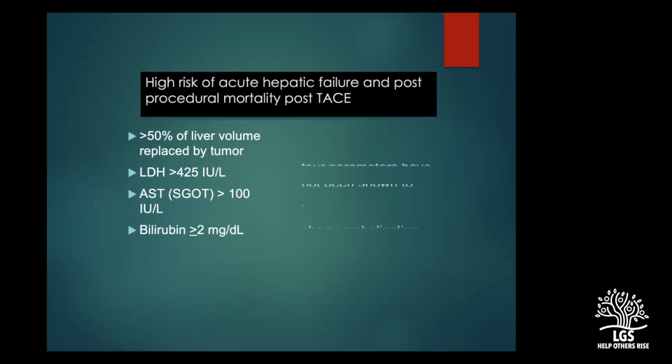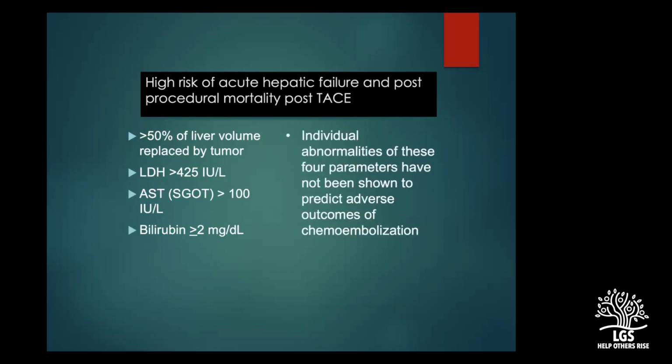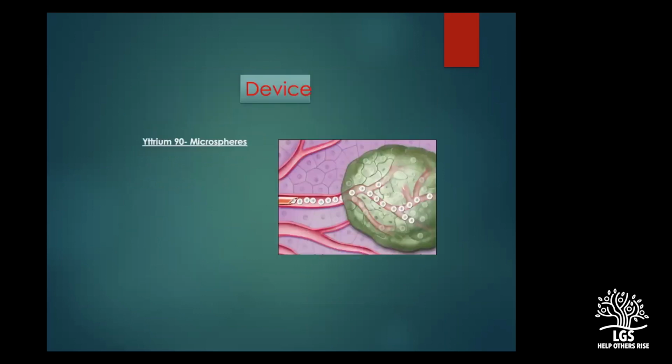A very short, a few slides on TARE. So Y90 microspheres are usually used in TARE procedures, as we all know. The Y90 drug that we're talking about is a pure beta emitter. In terms of the technique, it's pretty much similar to TACE. How does TARE differ from TACE? I'll explain to you all.